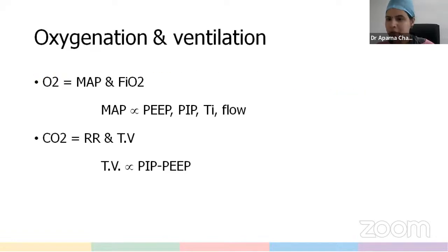So I'll stop here. We have discussed the 6 different variables or knobs that we operate during ventilation. And we have discussed how we will decide these settings initially. Which 4 settings can be decided based on the underlying diagnosis, and which 2 settings will be determined based on the severity of the disease.